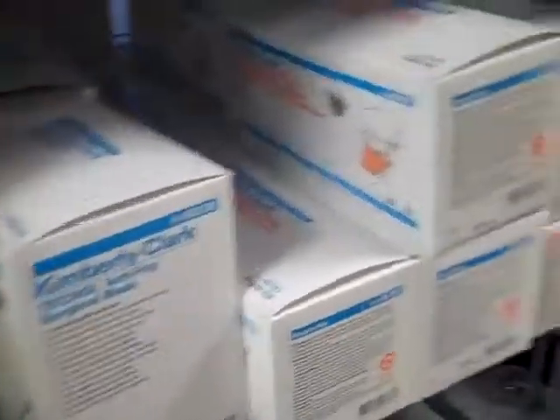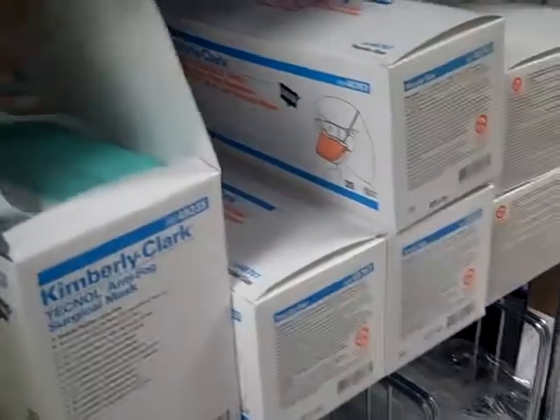It's probably a good idea to get your doc one of each extra, and any extra supplies can always be returned to the storeroom. The other thing to get is a face mask. The face masks are located further down in the storage room over here on the left hand side — you'll see these blue surgical face masks.